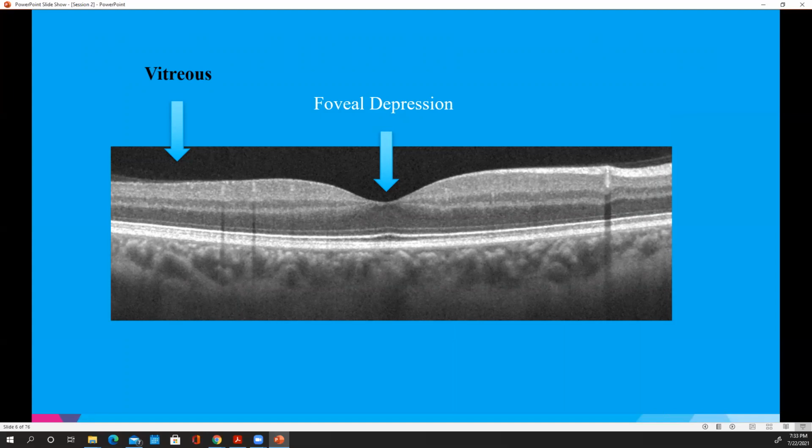So in this case, when you see exudates from diabetes, exudates in the OCT come up as white, but if you had them inverted, they'd come up as black and it just wouldn't make as much sense. So vitreous has to be black in order for this whole structure to start making sense. You always see it this way because that's conventional.